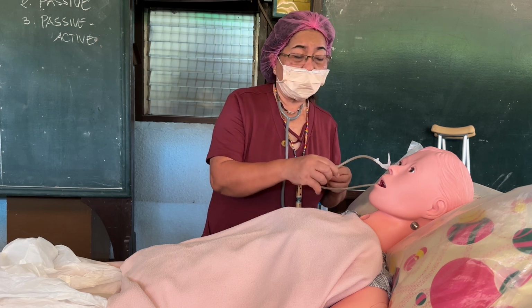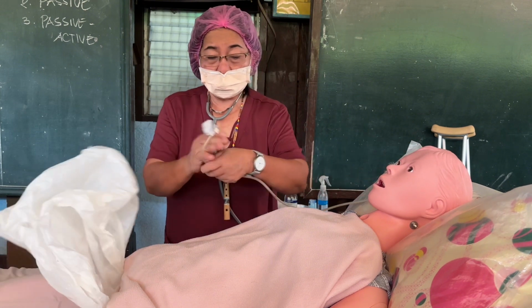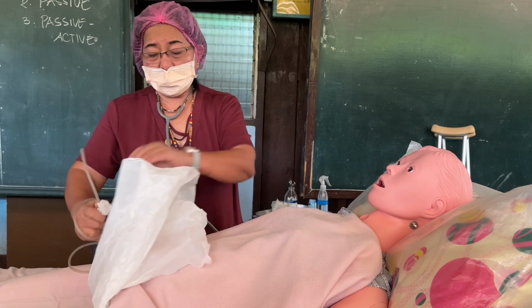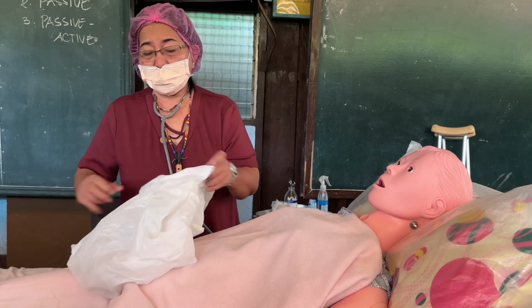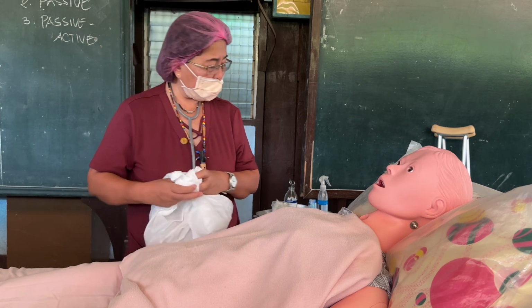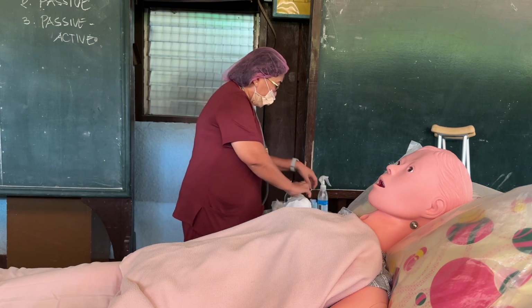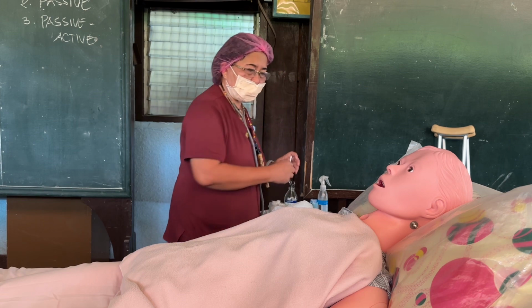Okay. 1, 2, 3. Okay, ma'am. Careful, pull it up. Put it inside the receptacle, including your gloves, class. Seal it well, then put it in the receptacle. After that, you clean the nostrils.